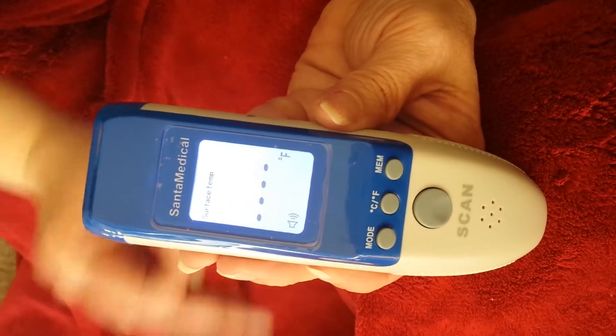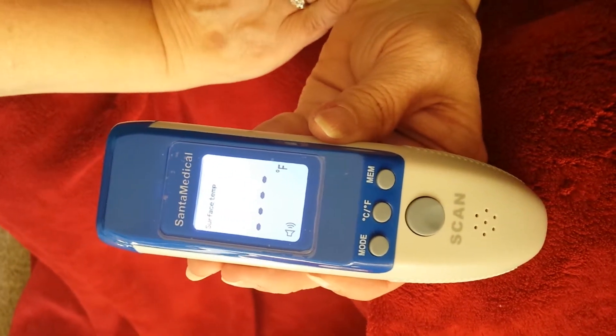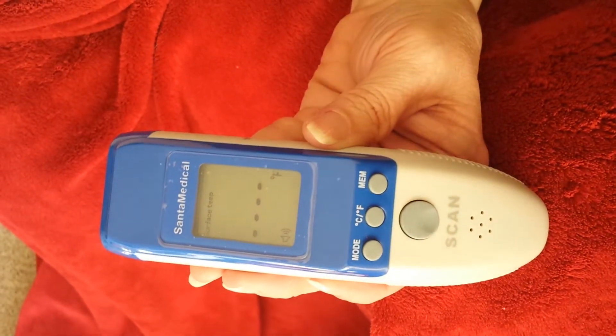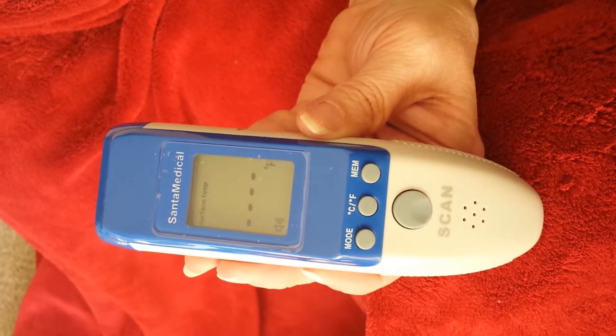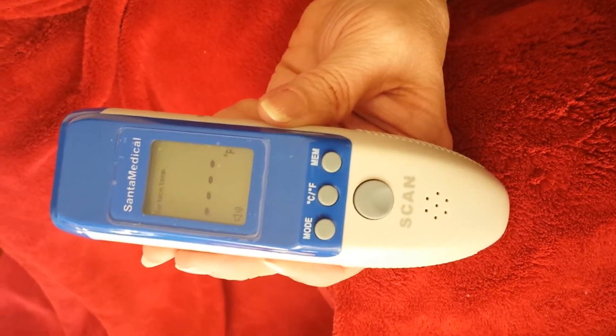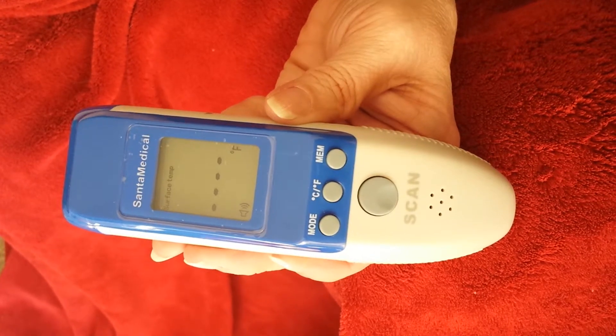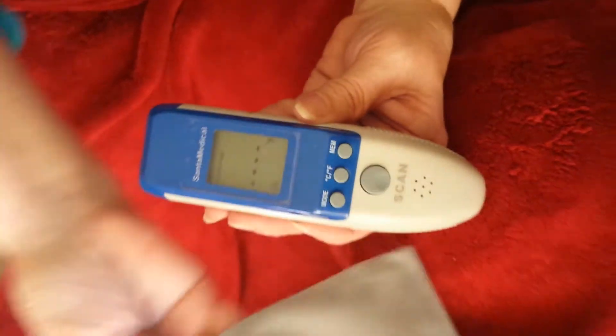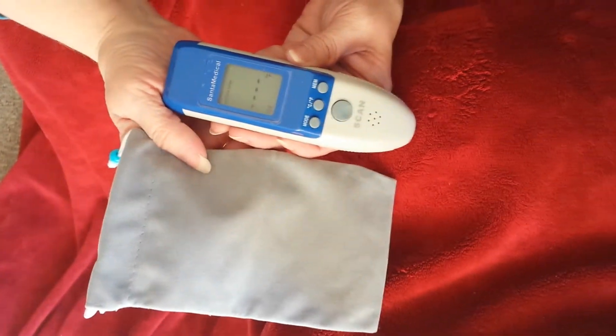We think this worked really well. You do not have to hold it right on something to get the temperature, so you're not actually touching someone's forehead — you're just holding it close. It comes with batteries and it comes with this handy carrying case.